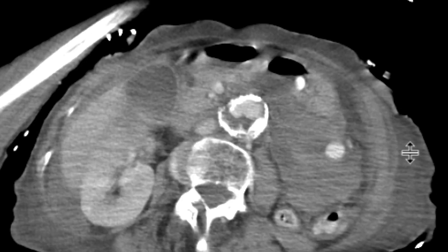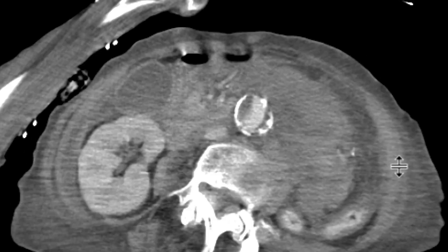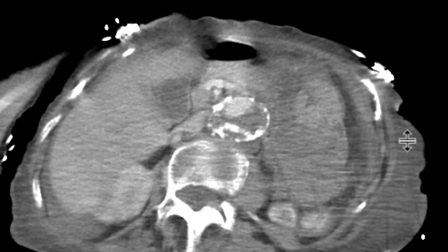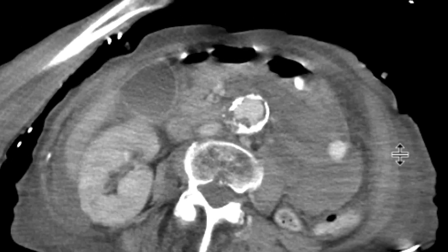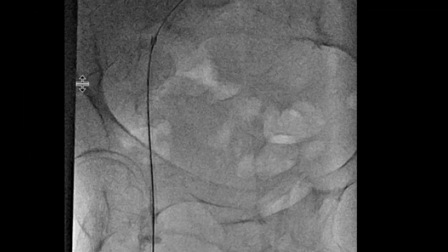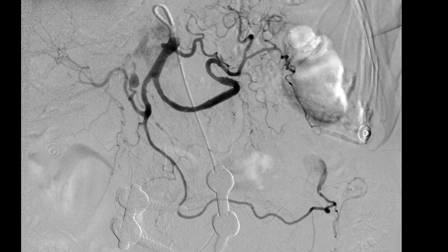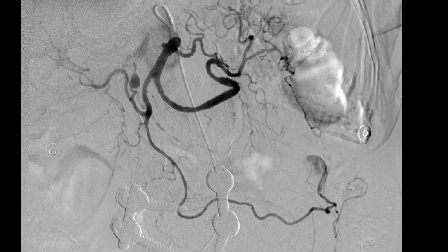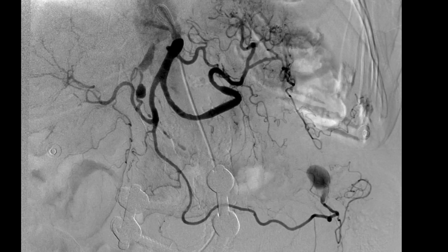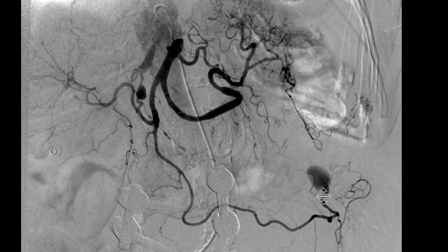It's difficult to know which vessel this arises from, given its location with respect to some of the other organs, such as the stomach. Perhaps this is the right gastroepiploic artery. This patient went to interventional radiology. We can start to see very beautifully the anatomy, and certainly this contained collection of contrast right over there — it's arising off this vessel, which is really a branch of the gastroduodenal artery. This indeed is the right gastroepiploic artery.